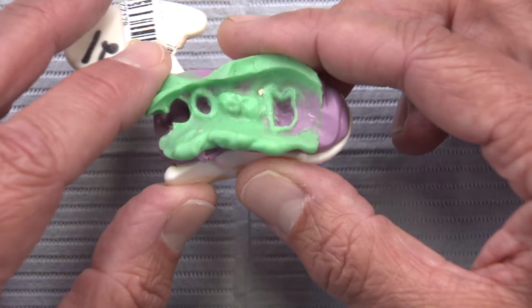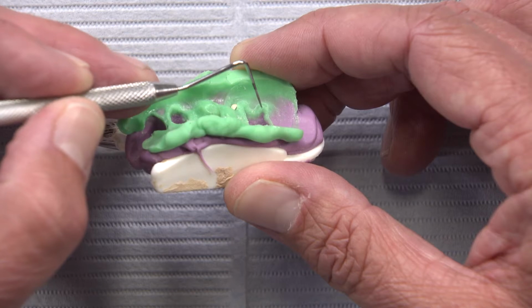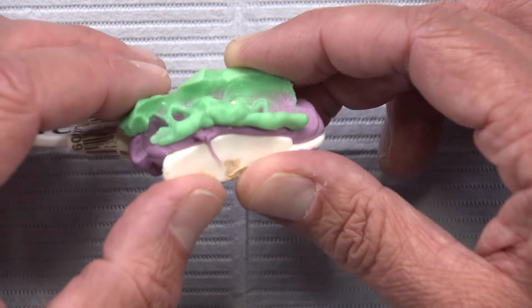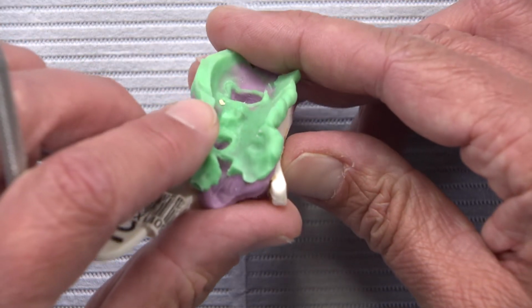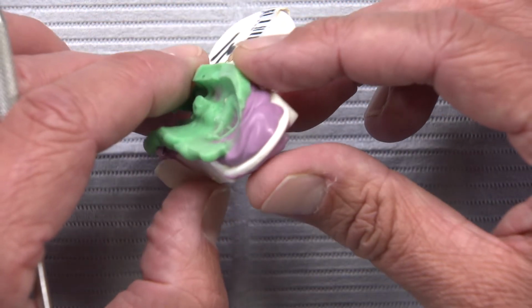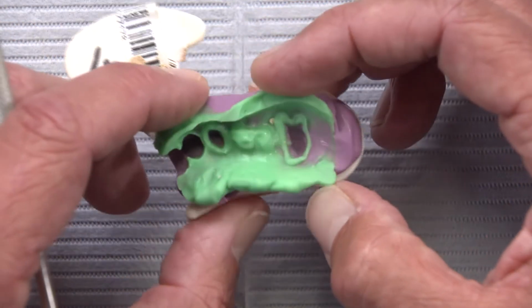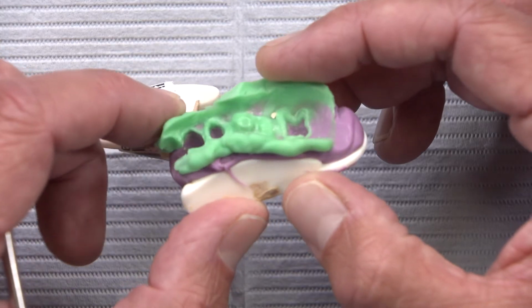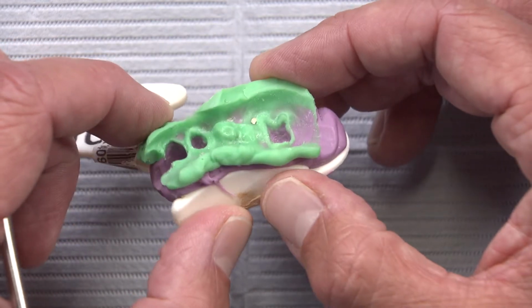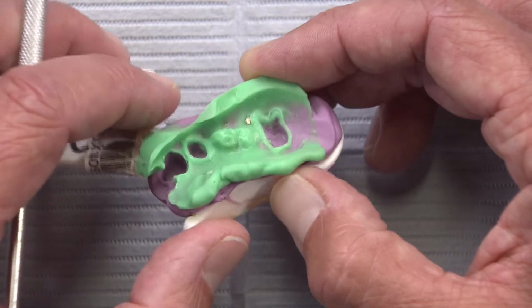If we just look at the margins here, at least here I can see some material beyond the margin, which is now my personal kind of signpost for whether or not I've taken a good impression. But then in other areas, like on that distal, the end of the impression is the margin as well. And on the mesial, the same thing. It becomes very difficult to trim those dies if we don't have that material beyond the margin. So as we look around, a lot of what we see here does not have that flash material beyond the margin. Even just a little like this is really helpful on the buccal aspect of that molar for getting something cleaner.